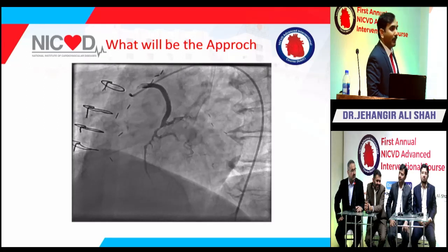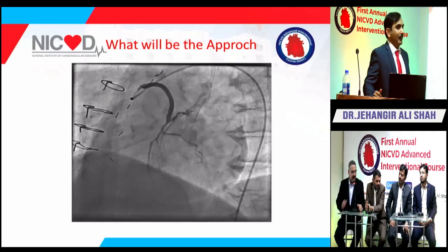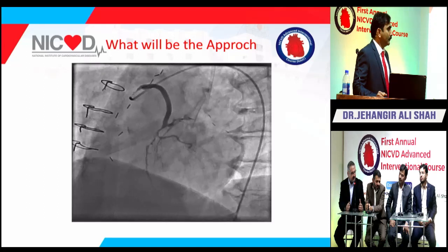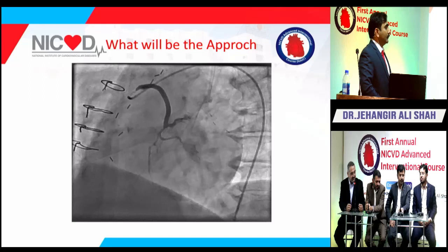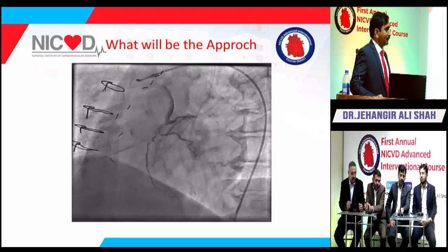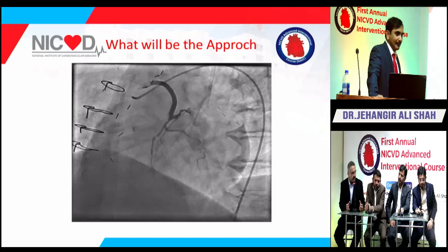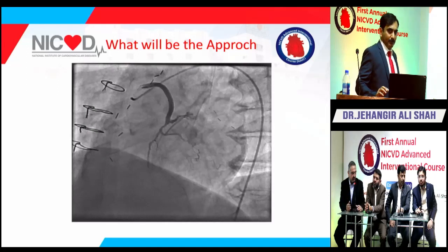And secondly, Dr. Javed, I just want to add another point here: like they said, the studies have proven that if you are not going for embolic protection devices, it is especially essential to go for undersized, longer stents. So in our scenario, we are not going for EPDs. The best approach would be to go for an undersized stent rather than an oversized or 1:1.